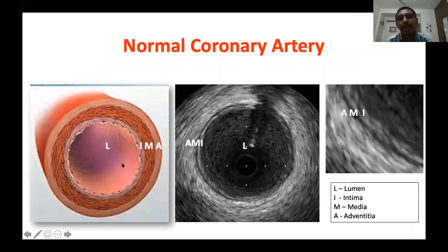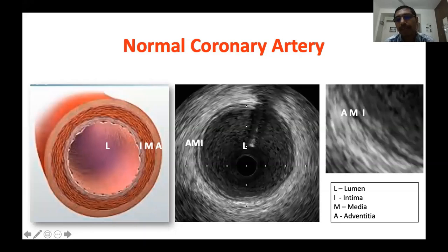How does a normal coronary artery appear on intravascular ultrasound imaging? The lumen appears echolucent with blood speckles — small white spots — otherwise mostly echolucent, with a catheter in the middle. With a solid state system, the guide wire runs through the center of the catheter, so you don't see any guide wire artifact. With a mechanical system, the guide wire runs outside the catheter, so you see a wire artifact in the image.